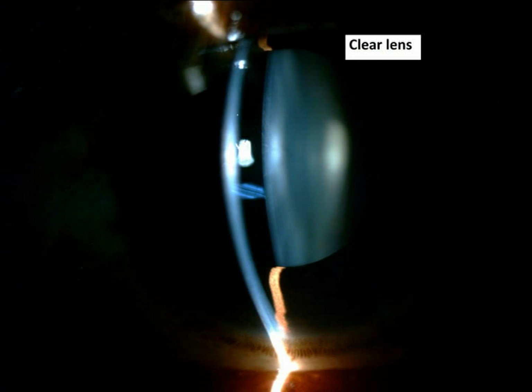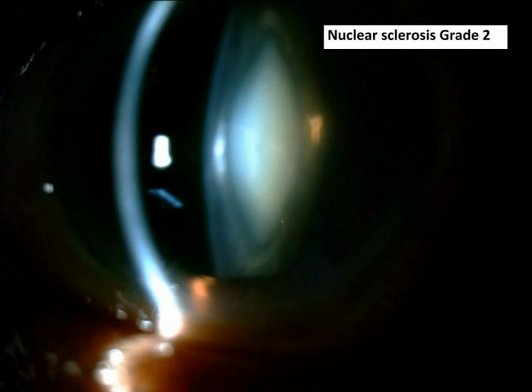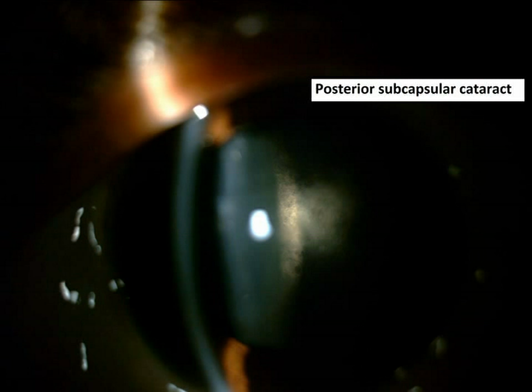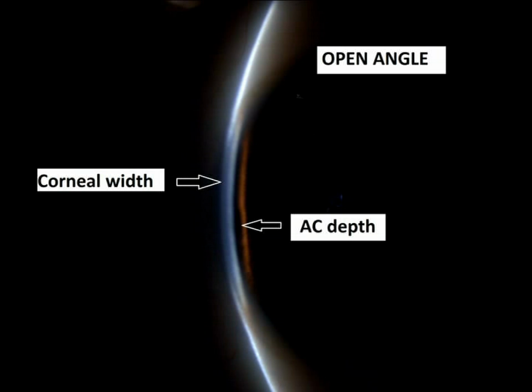The optical section on the lens is used to find the site as well as the grade of cataract. Clear lens, nuclear sclerosis grade 2, nuclear sclerosis grade 3, grade 4 or brown cataract, posterior subcapsular cataract. Principle of optic section is also used in Van Herick's grading for assessment of the depth of anterior chamber, and narrow slit is focused at limbus to compare the width of the cornea to the dark section between the cornea and the iris. When the anterior chamber depth is less than 1/4 of the corneal width, it is named shallow.